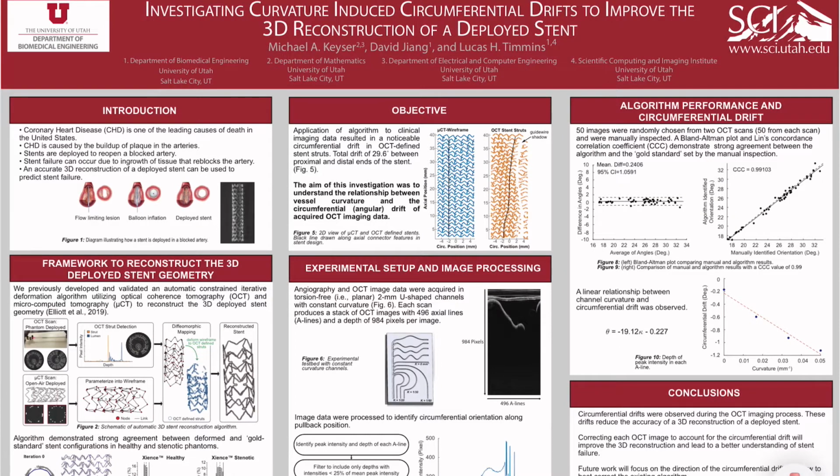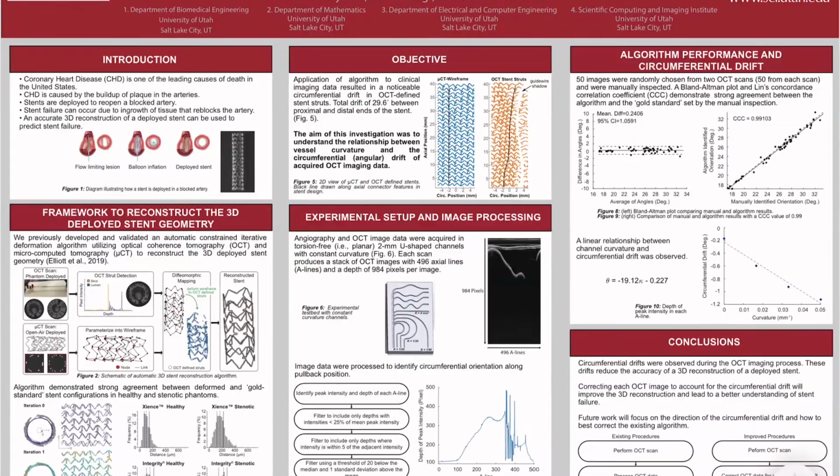Coronary heart disease is one of the leading causes of death in the United States. It is caused by a buildup of plaque that restricts blood flow in the arteries. Typically, clinicians can insert stents and reopen the blocked arteries. However, stent failure can occur, and an accurate 3D reconstruction of the deployed stent can be used to better understand the effects the stent has on its surrounding environment.